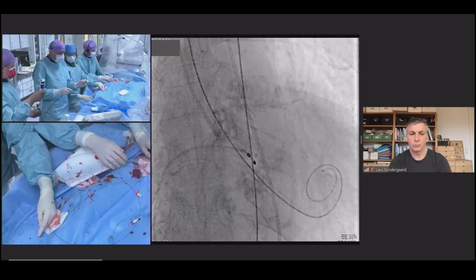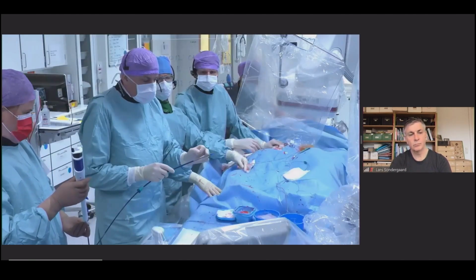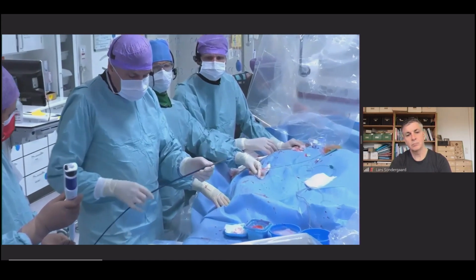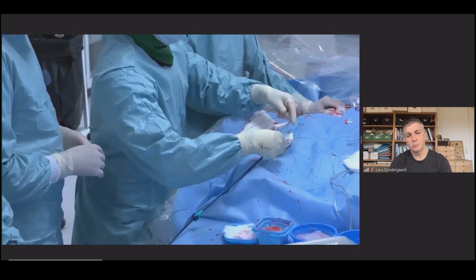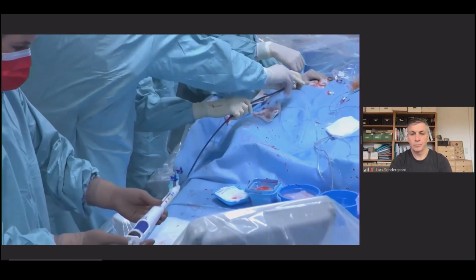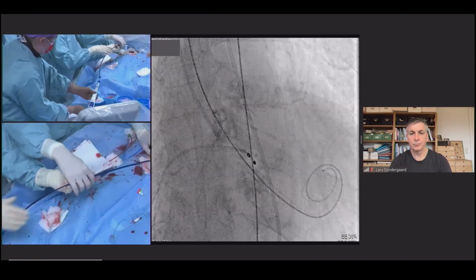You can zoom in here, we have this nose cone, we have the capsule. At the end of the capsule, there's a radiopaque ring here. And then you have the inline sheath here, which makes it 14 French comparable. Let's make it nice and wet, indeed. Somebody holds the sheath.